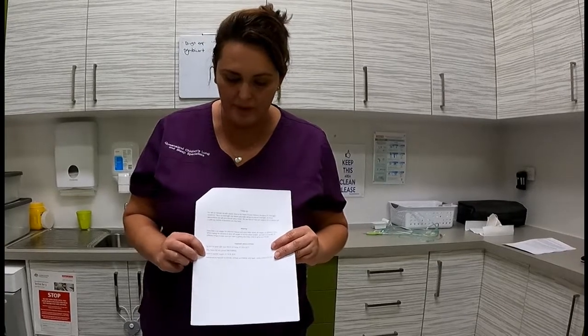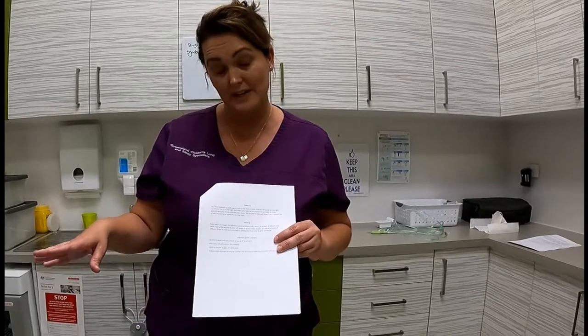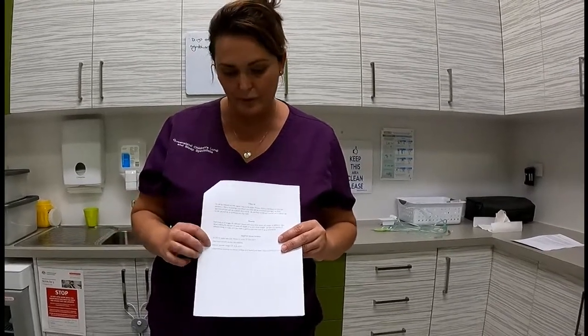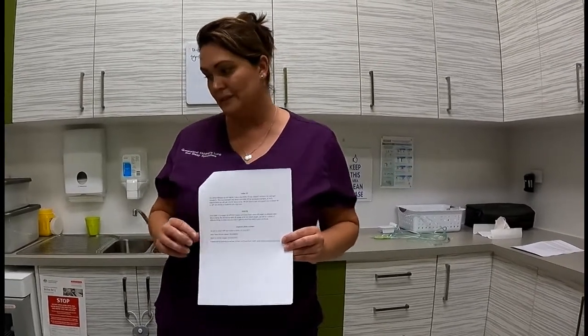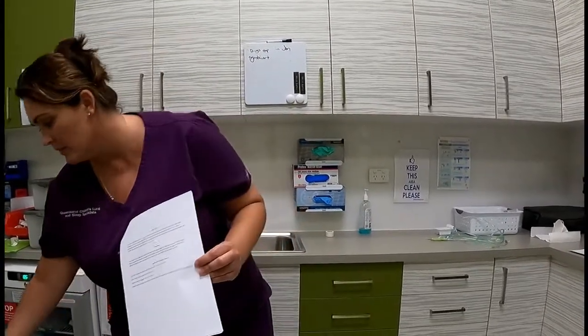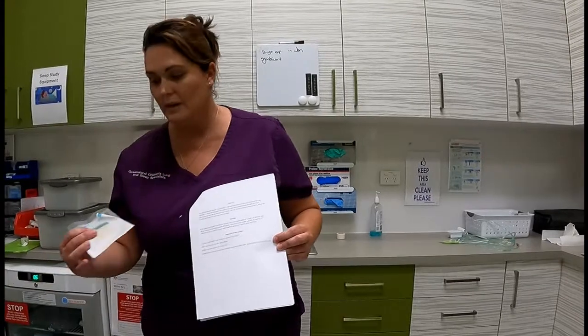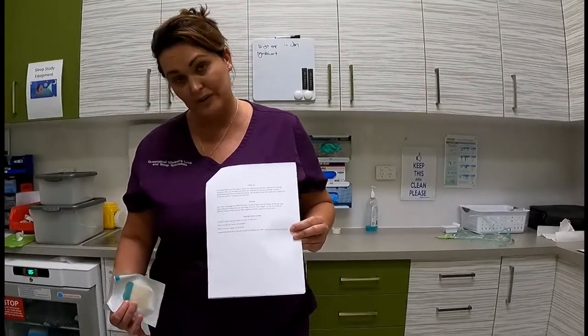This is the number for MAS to reorder your oxygen. So if you're finding that you're needing to get new tanks, this is the number you call. This website here, Independence Australia, that's the one I find is the best place to order your tapes. So your Fixomull and your Comfeel for taping on your baby's oxygen.